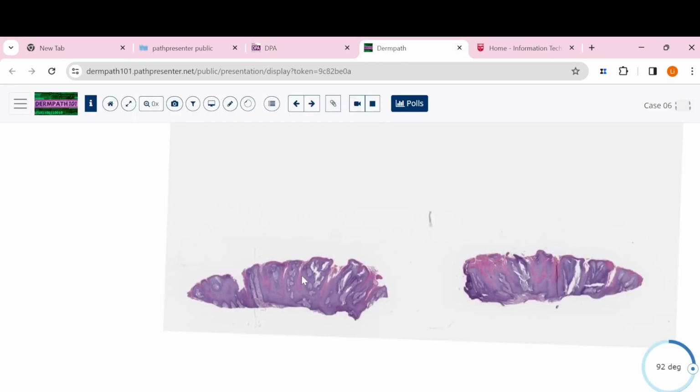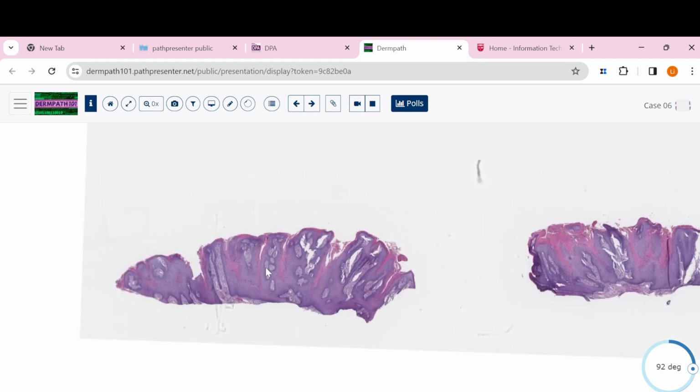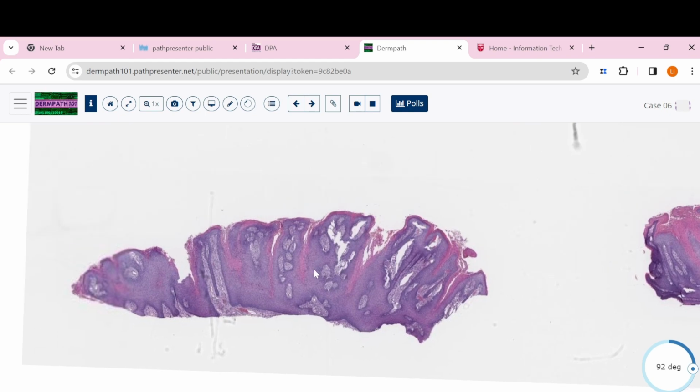And then the last one I want to make a differential diagnosis with is this one. This one also looks kind of warty, but at a little bit higher power, you can see the color of the parakeratosis is kind of different. This one is kind of hot pink, just like you lit a fire on top of this wart. So when you see this really red, pink parakeratosis and it looks like a wart, you should be highly suspicious that this is not just a wart.